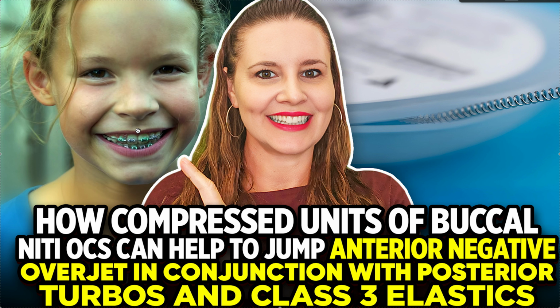Upper incisors are tipped back. They just got stuck on the lower incisors. These things happen. Not a big deal. How do we move them forward? Of course, it's much easier with Invisalign because you can totally control that, right? But let's say you're in braces, a little more tricky.